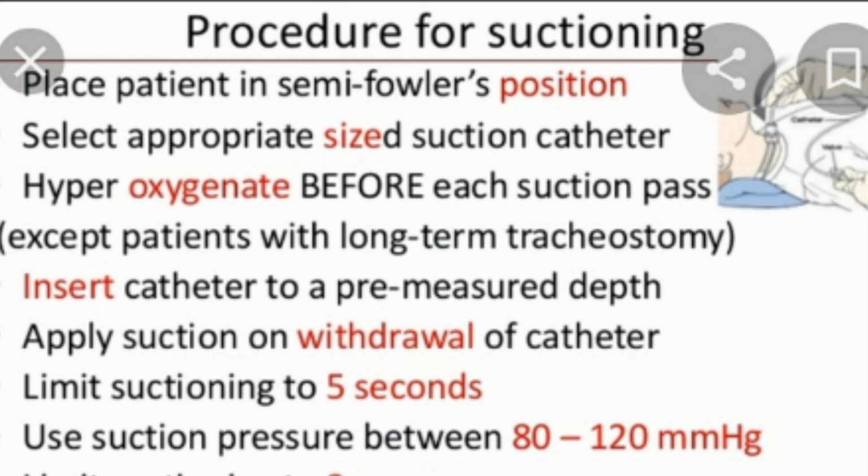Our second important point is select an appropriate sized suction catheter. We have many sizes of suction catheter. If the patient is pediatric, we have to take the small size. If the patient is adult, we have to take the big size. So select an appropriate sized suction catheter.